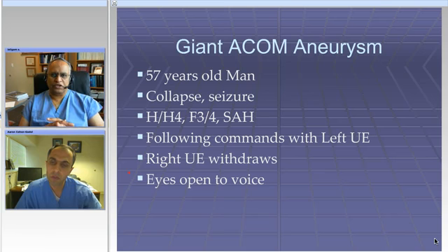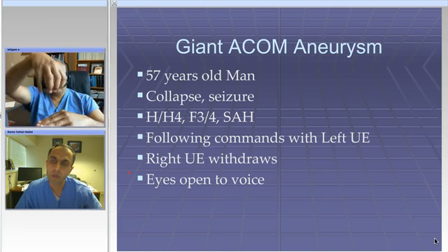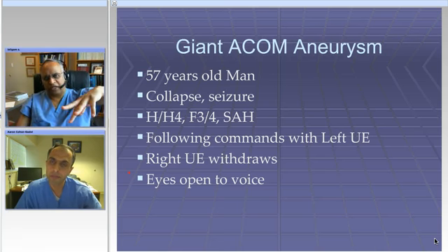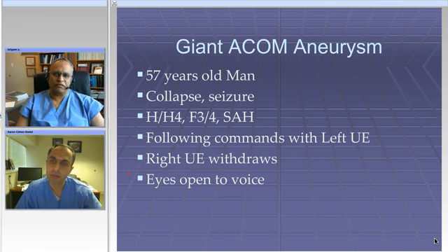The other thing I didn't show in these videos is that I frequently use something called the rubber dam interposition technique. I dissect the perforators, and I interpose a small rubber piece, what I call a rubber dam, in between the aneurysm and the perforators. So when I put the clip on the back side, the clip slides along the rubber dam, sparing the perforators. I use it very frequently with basilar tip aneurysms.